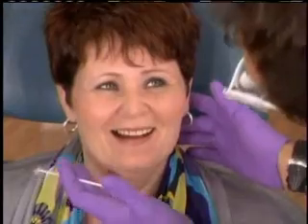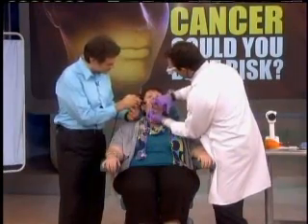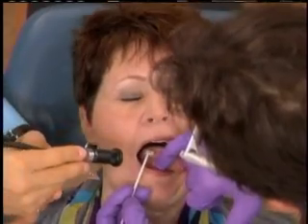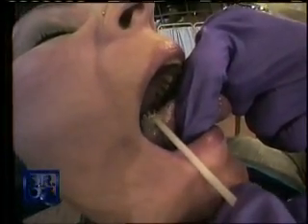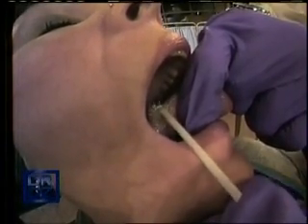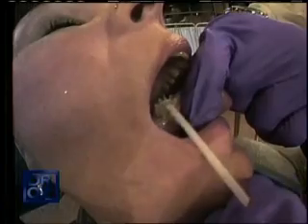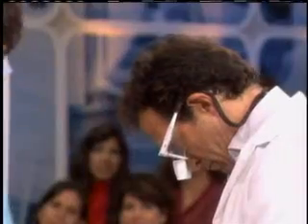Yes. Okay. Please put your head back a little bit. Open for me. Now stick your tongue out and let's make believe there is a lesion on the side of the tongue. And all we're doing is placing the bristles into it with a little twisting action. And now the cells are up on these little bristles, and this is then placed on a slide. Did that hurt, by the way? No, not at all. Okay, good.